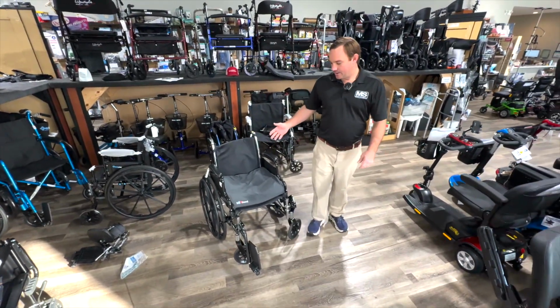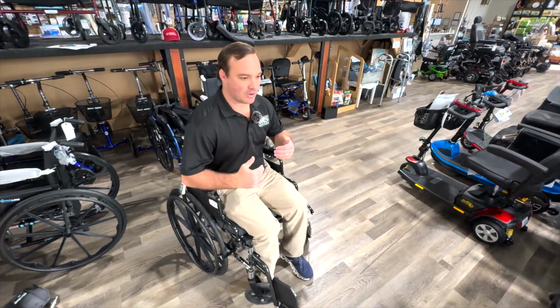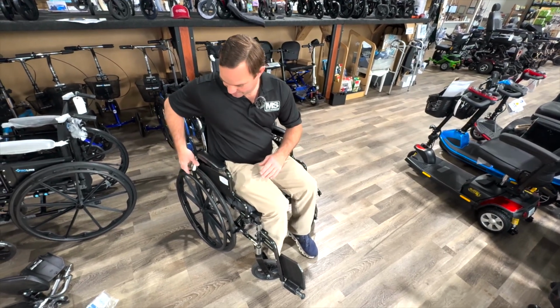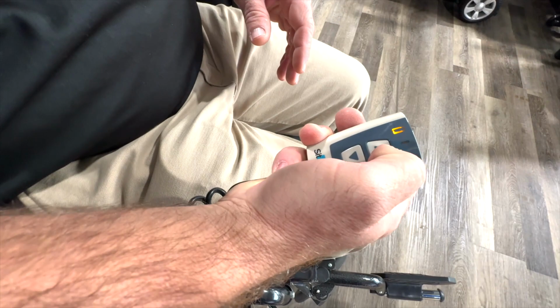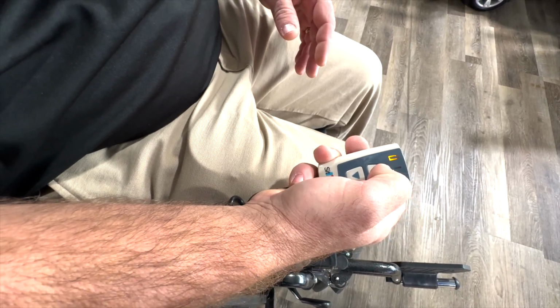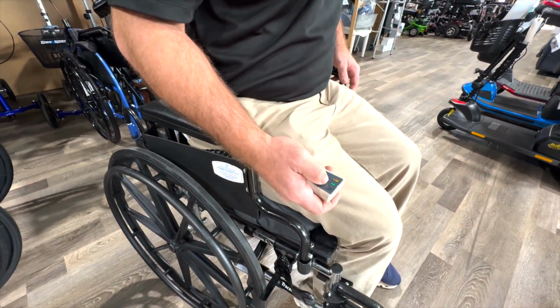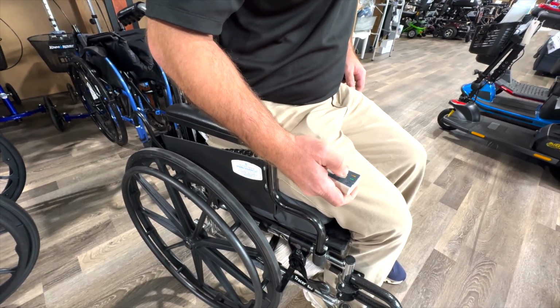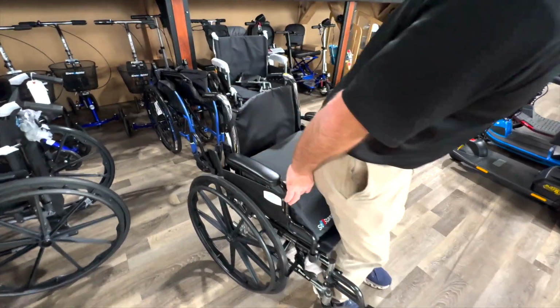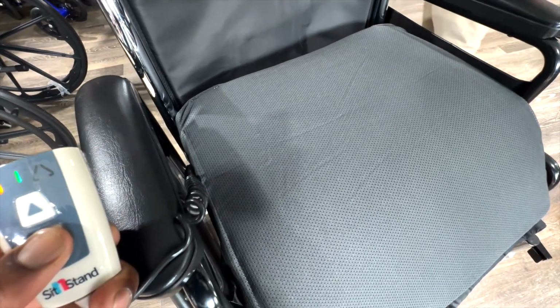So basically, this has a little bit of a cushion to it. It's like a memory foam cushion. And if someone's having a hard time standing up, or if you're taking care of someone, you're having a hard time getting them up from a dead sitting position, you press this button, it'll be 3 different stages, and it puts air into this. You're going to want to hit it 3 times, or you can get out whenever. And it's acting like a lift chair. So now I'm coming out. So it's just like a lift chair.